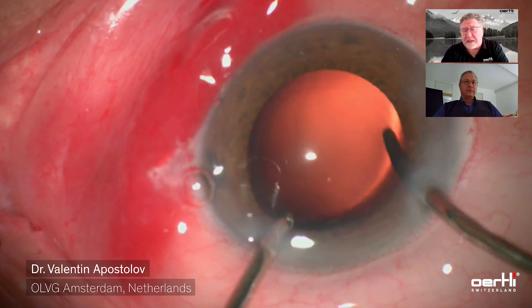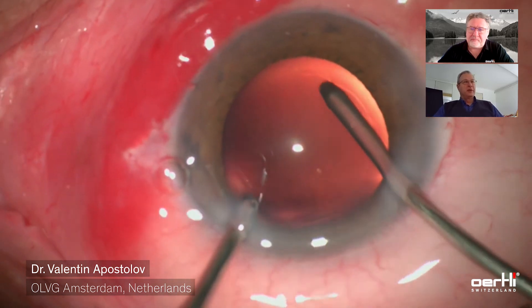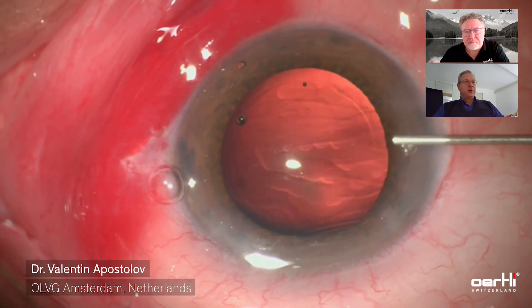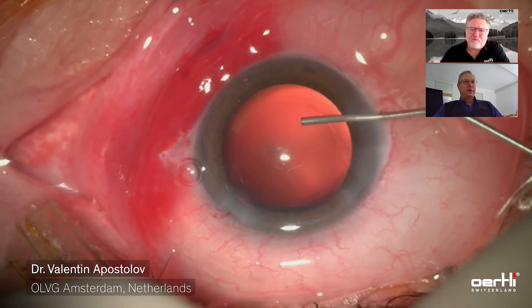That is of course a big compliment to us. We are very proud of our bimanual instrument — surgeons, as soon as they gain the trust, also go and touch the capsule and feel comfortable, but it is always a learning curve in how they can trust the IA instrument. Sometimes there are some small peripheral remnants that you can safely grasp in capsule polishing mode. Here, cohesive OVD is being injected into the eye, filling the capsular bag and the anterior chamber, and next a one-piece hydrophobic acrylic lens is being implanted.